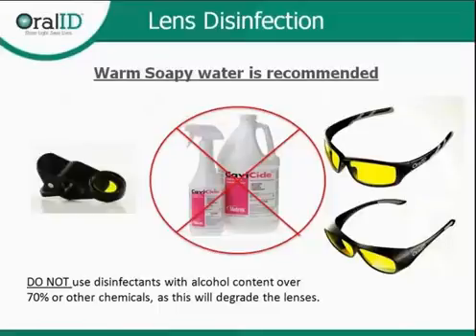So we do recommend warm soapy water is really ideal, or if you have some cleaning agents that are the lower alcohol. So you may want to get additional brands of wipes for that. We're actually testing a couple right now to see if that would be a good recommendation. But bottom line, if you do have to spray and wipe them, just at the end of the day, use warm soapy water to rinse them and clean them so that those chemicals don't just continue to seep in on there.